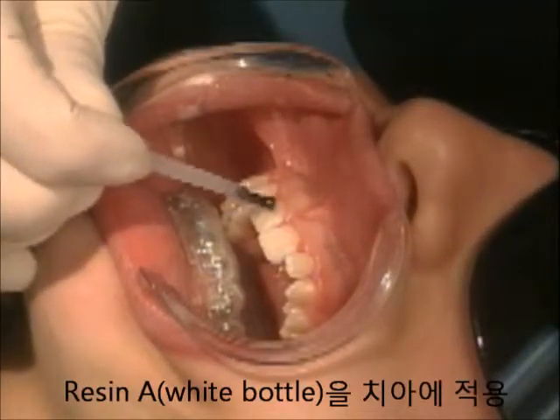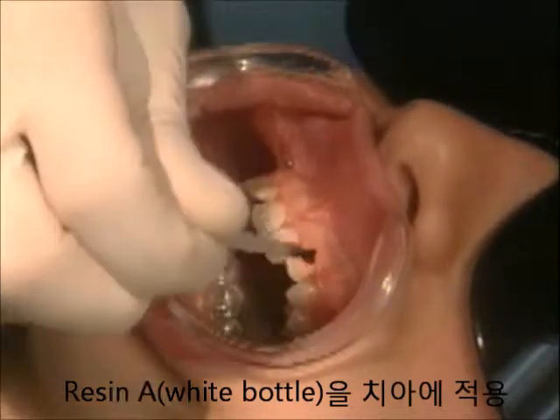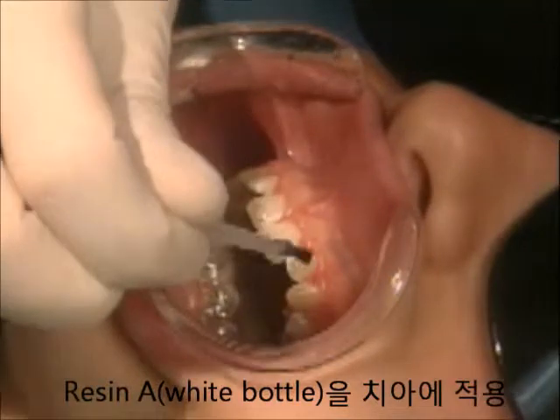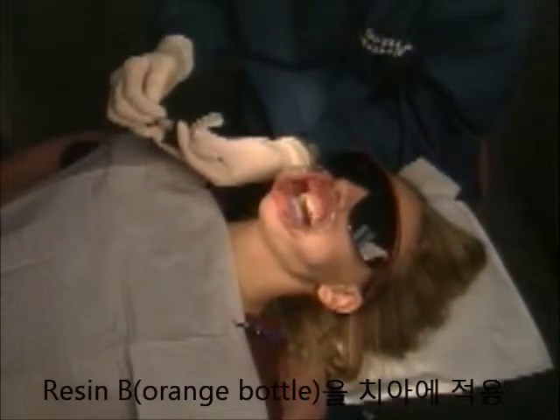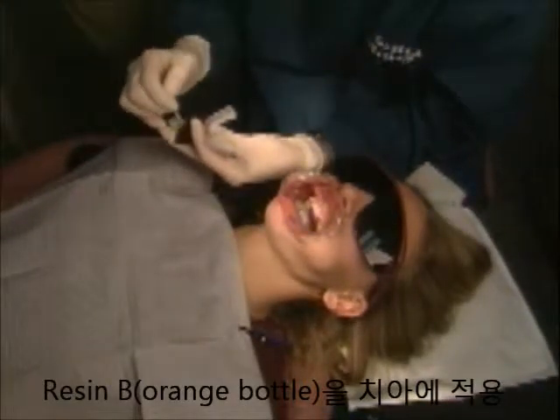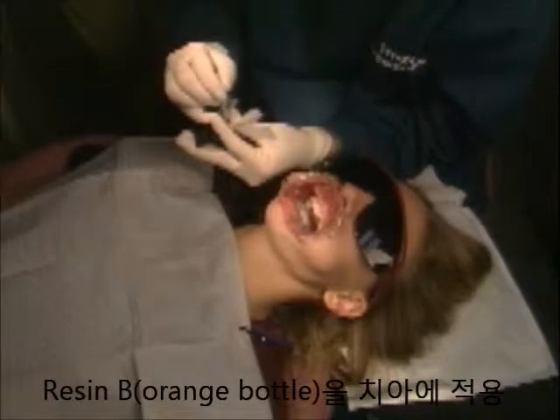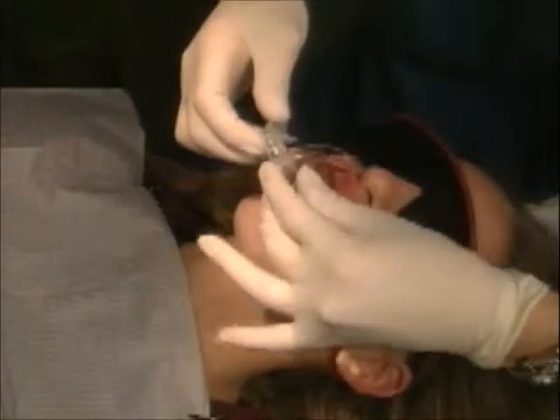Repeat the preparation and isolation for the upper arch using the same technique. Paint a thin layer of resin A on the upper teeth. Paint a thin layer of resin B on custom resin bases using a different brush. Note that the resin working time is not an issue until resin A and resin B finally come into contact, with a hinge motion.